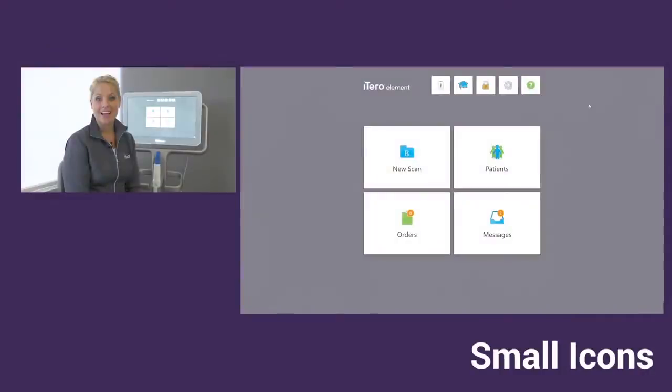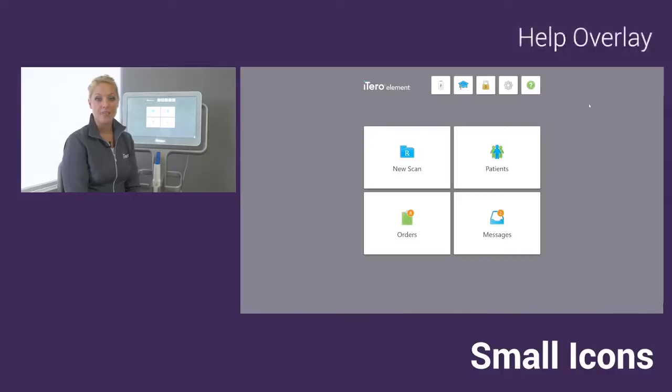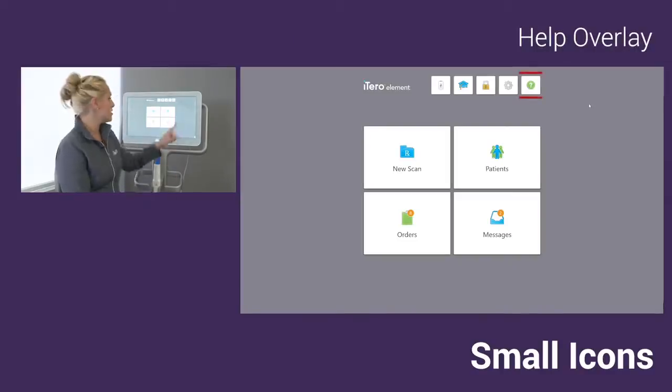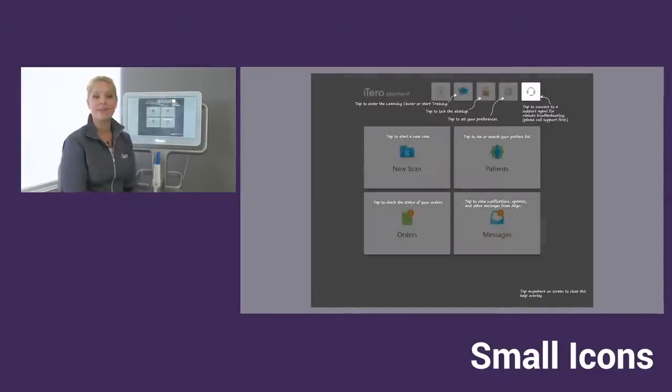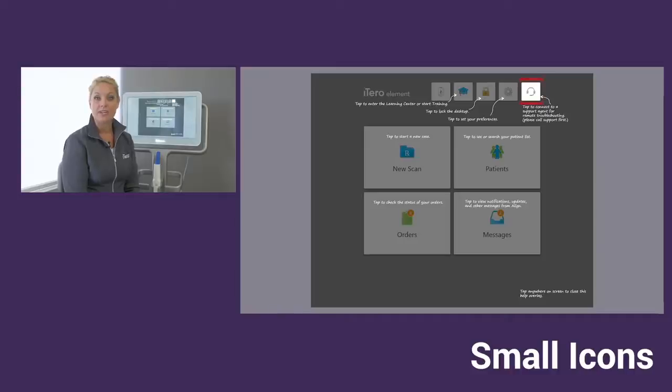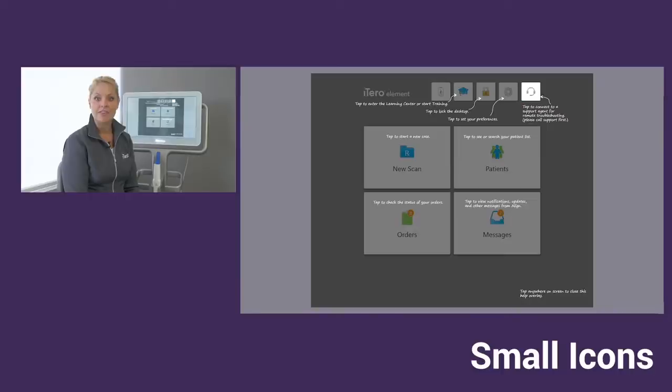We're going to cover the small icons on the screen. They're going to be helpful when you're using your iTero element scanner. First, we're going to start with the help overlay, which is your question mark at the top right. When you tap on the overlay, it will give you a description of what all the items on the screen are for, and that's going to be helpful as you get used to all the different areas in the software.